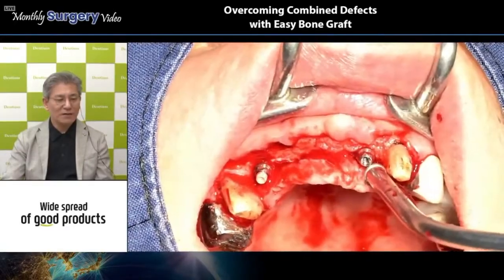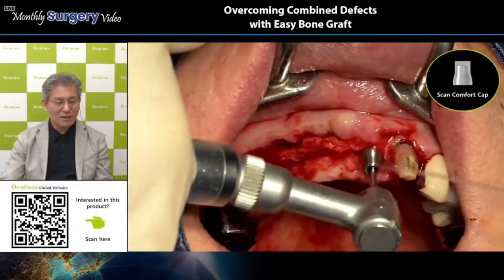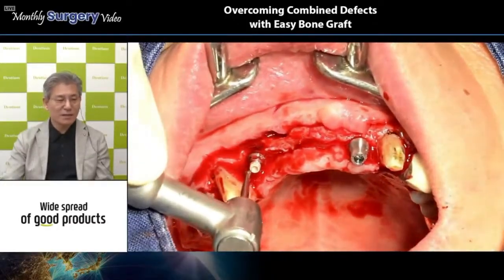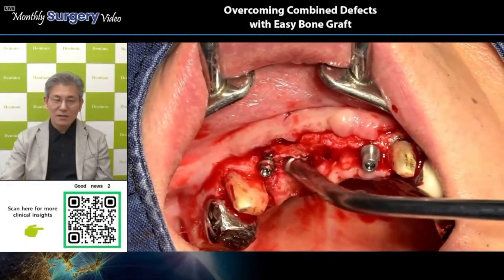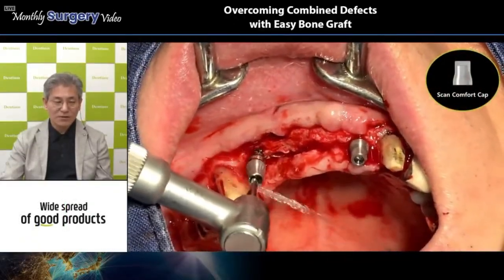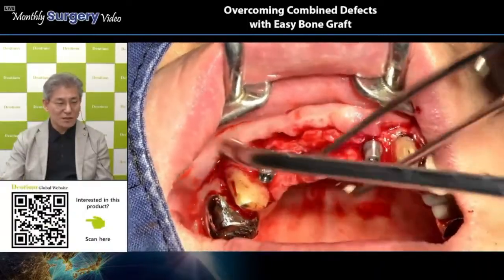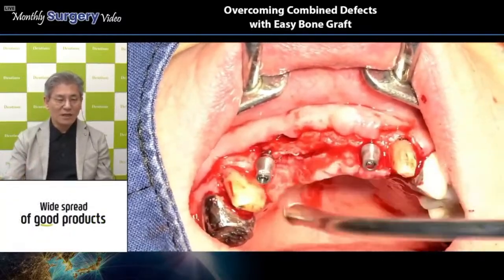Remove the plastic cap. This plastic cap works as a protector on the screw thread, right? And connect with the scan comfort cap. This scan comfort cap works first as a healing abutment. Second, it works as a scanning jig. Third, it works as a dual abutment-like function for the combined temporary prosthesis, a PMMA temporary prosthesis. Can you see the notch? These notches are for the scanning, right?